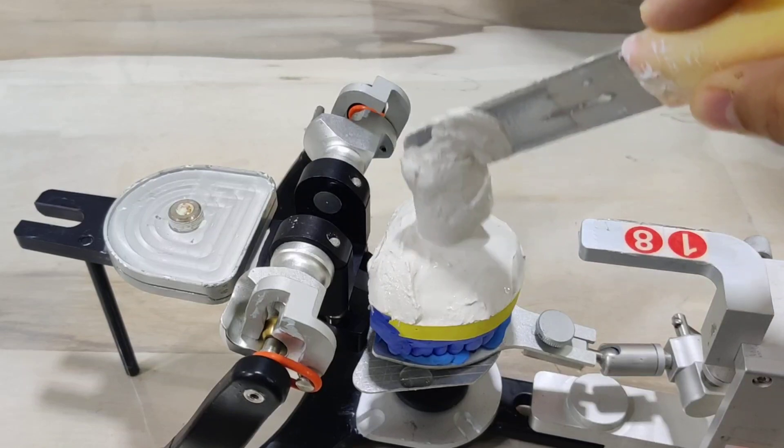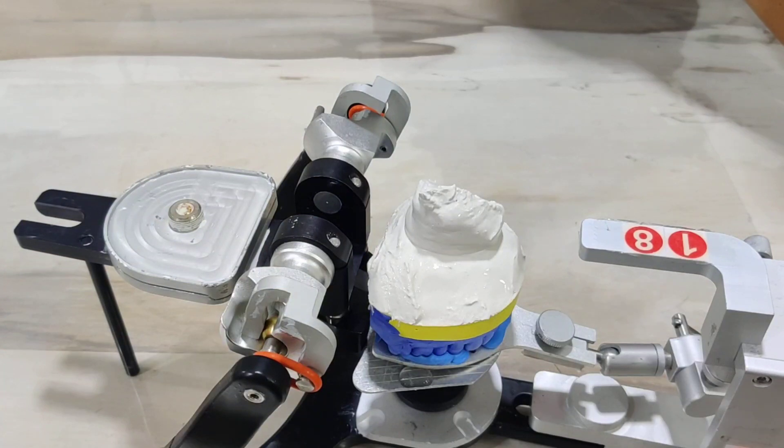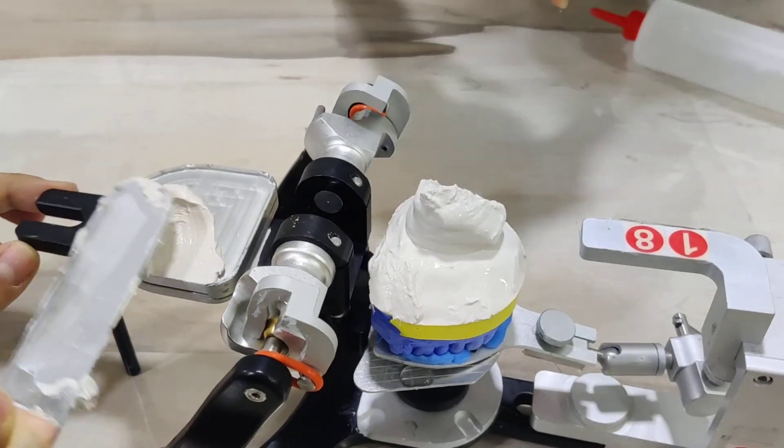We take more plaster but this time we will adapt it onto the mounting plate, adapting this around the entire periphery of the plate.